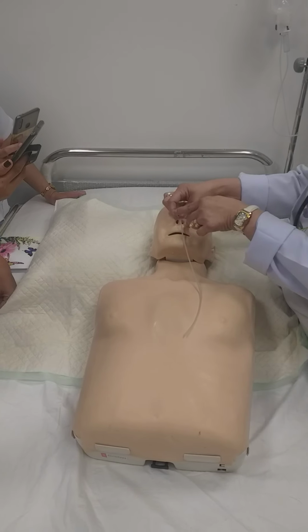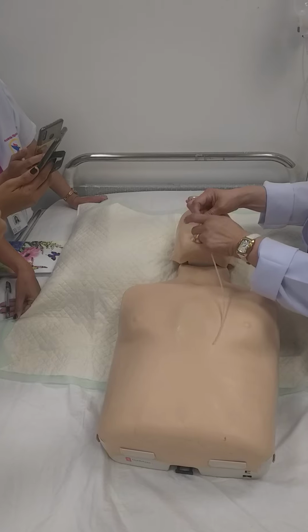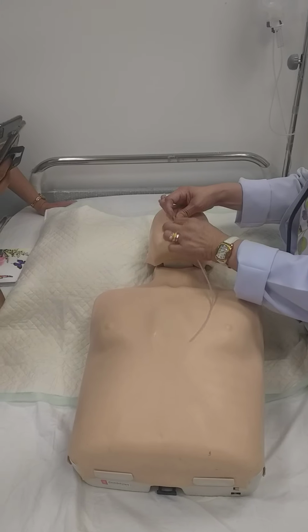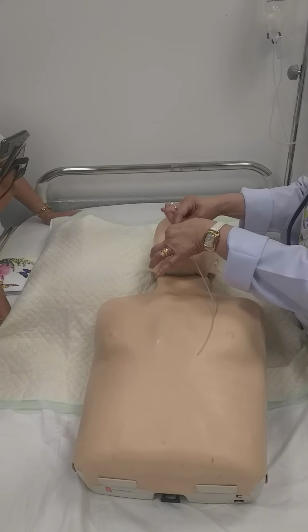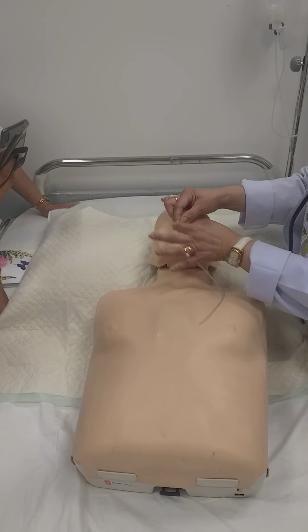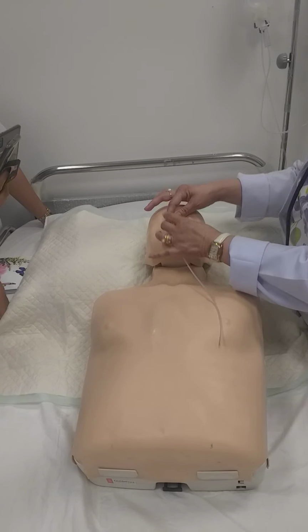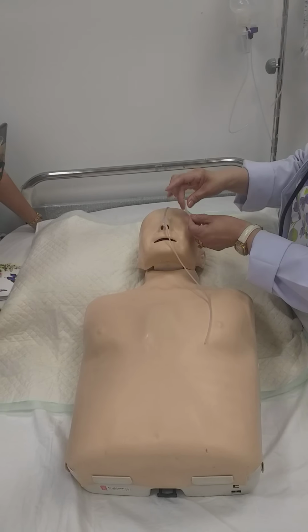Keep it on the middle. And these two, you have to wrap it with the tube. Wrap. So the other one, you have to crisscross. Make it cross. Okay, assuming this one is in. Okay. Now the third plaster, cover on top of it.